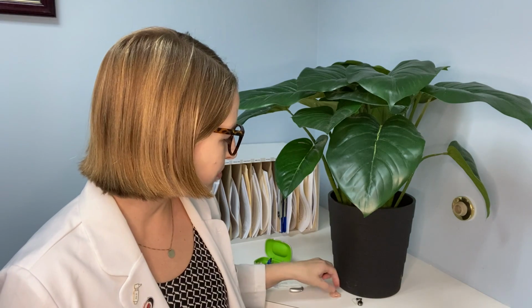There are also bigger in-the-ear hearing aids. This one here is a little bit bigger, but the nice thing about it is it's rechargeable. So that's another factor you have to consider. How important is using rechargeable batteries, or do you have the dexterity to change a tiny little battery? And so we work through those things when we're debating the different styles.